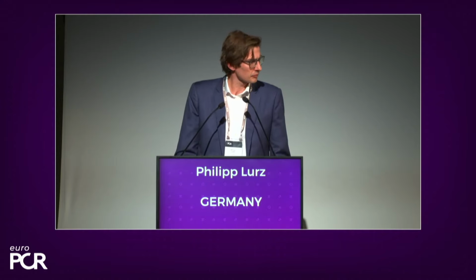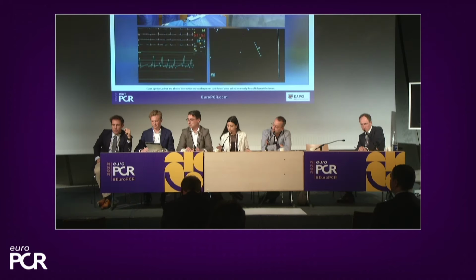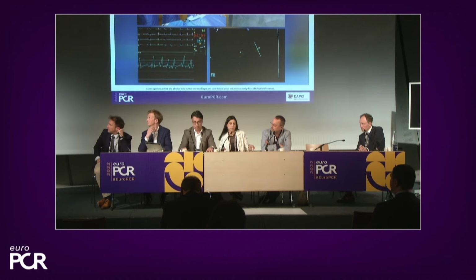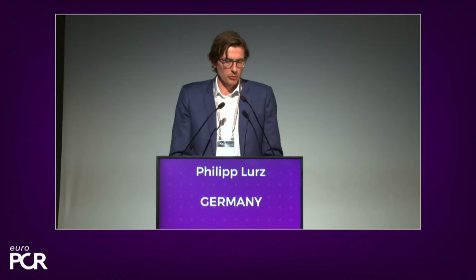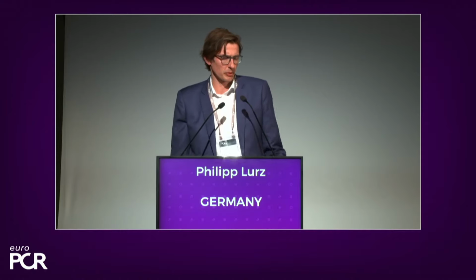And I think it's an amazing case. And we always discuss how important the transeptal puncture is. And what about this particular scenario? Yes. So what we do now more and more often, obviously we aim for transeptal puncture about 4 centimeters, and we try to be posterior.